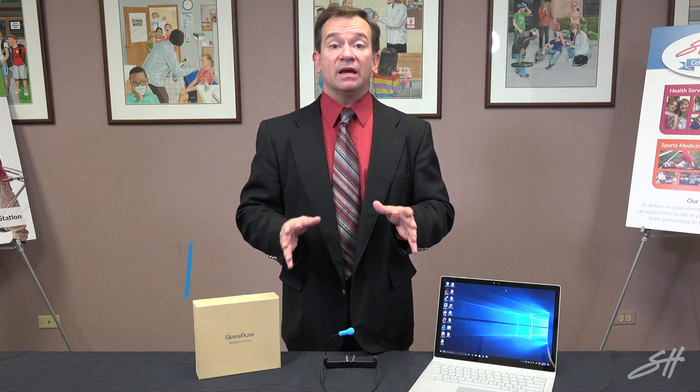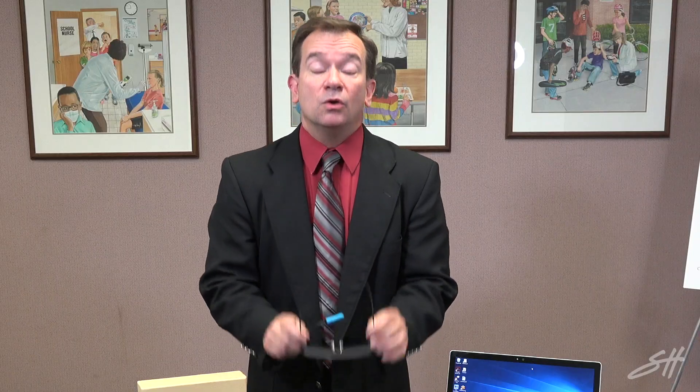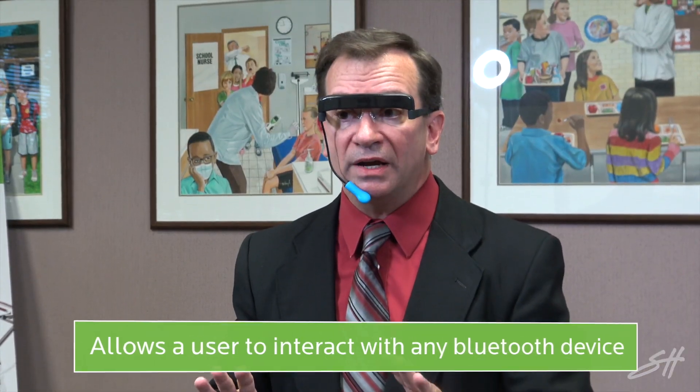Hello and welcome to SchoolHealth Presents product presentations. I'm Dr. Ray Hype and I'll be focusing on the GlassOuse today in this video. The GlassOuse is a device that allows a user to actually interact with any Bluetooth device without needing to use their hands at all.